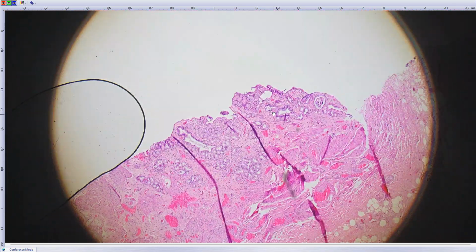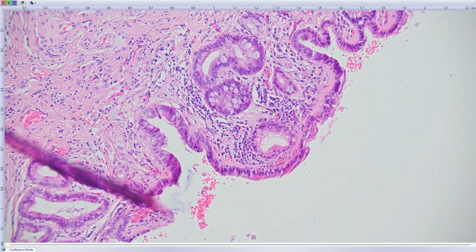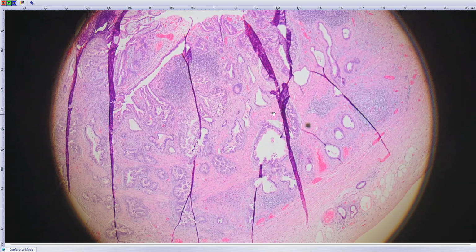And if you are asking whether this epithelium is dysplastic or not, I cannot really rule out low-grade dysplasia, but it does not matter, okay? Low-grade dysplasia or reactive versus low-grade dysplasia, it does not matter. In the gallbladder, high-grade dysplasia is what matters. In that case, you always have to submit the whole gallbladder, and high-grade dysplasia is always a straightforward diagnosis.